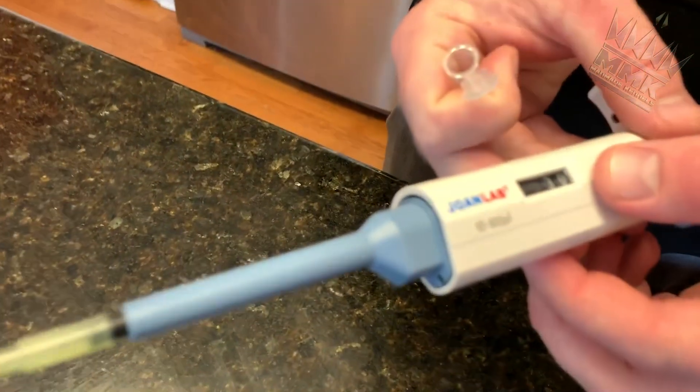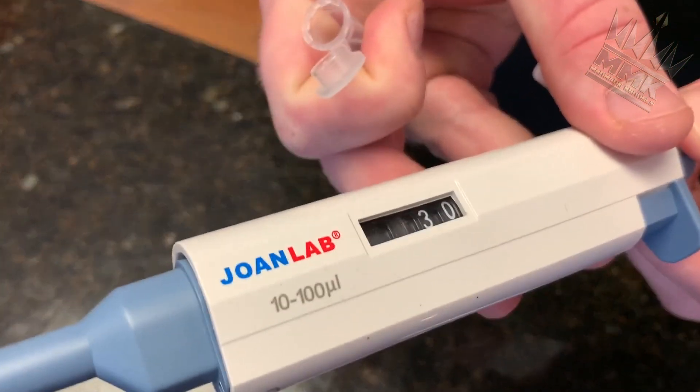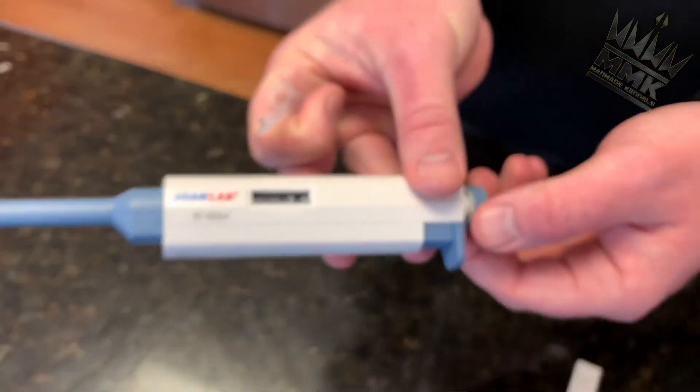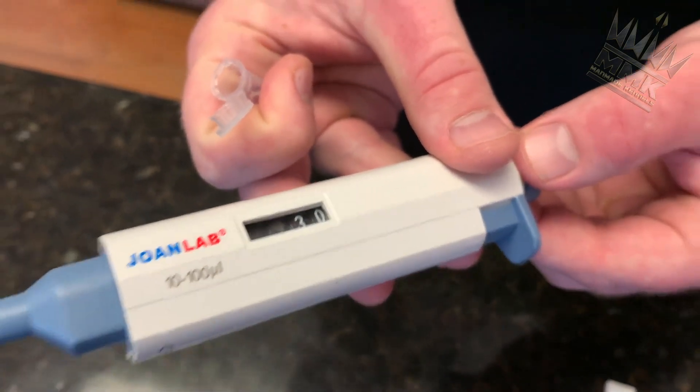We've already preset this part. How do you set the pipette at 30 ULs? You adjust it using the knob back here. We already had it preset at 30 ULs for this part.